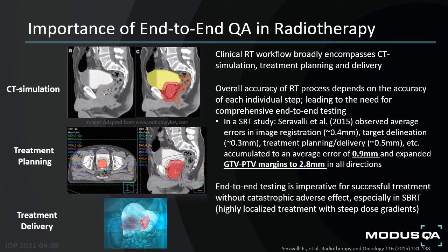As you probably already know, the clinical radiotherapy workflow is a complex, multi-step process designed to accurately deliver a biologically effective radiative dose to the target while still sparing as much neighboring normal tissue as possible. Very broadly, this process consists of a simulation device in which preliminary X-ray or CT scans are taken so that the margins can be contoured for both the OARs and the target, and the tumor volumes are delineated. Thereafter, you have the treatment planning system, where the ablative doses are prescribed and the treatment plan is created accounting for that dose distribution as well as its constraints.